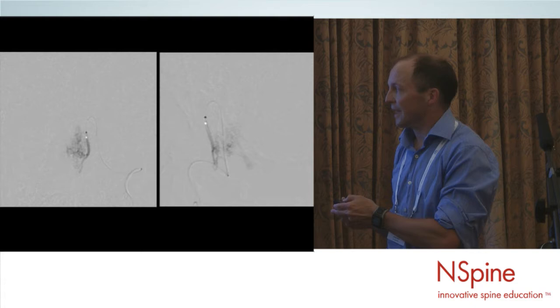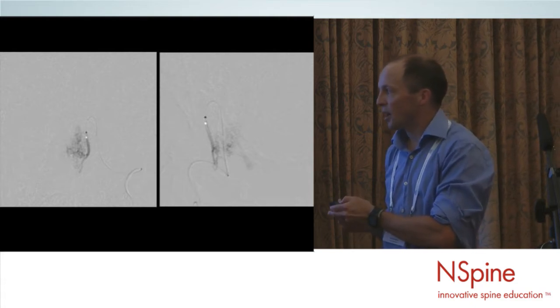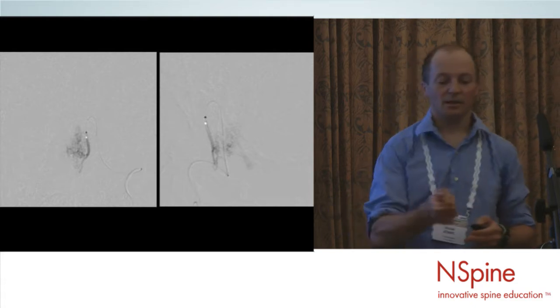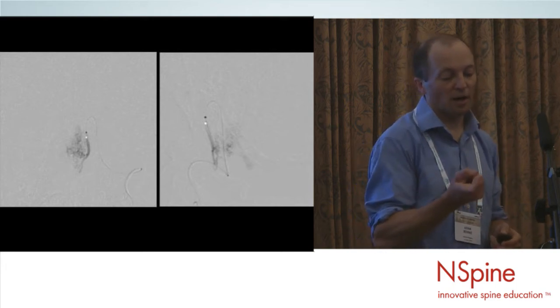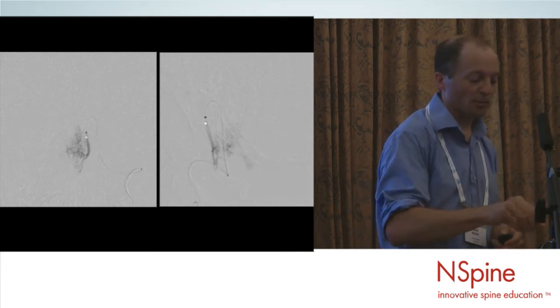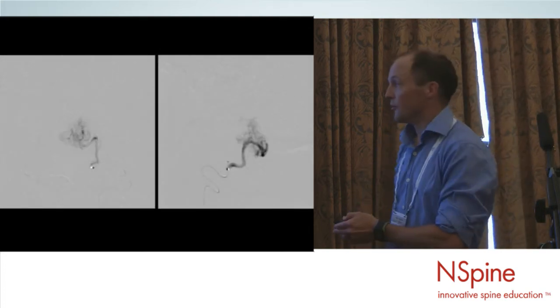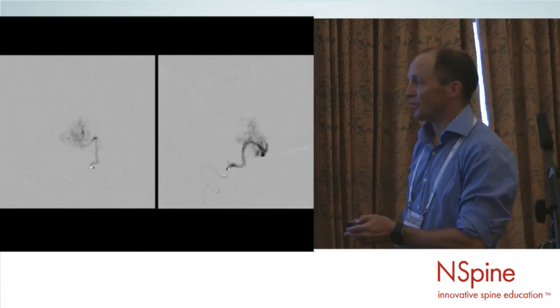So this is some lateral projection. This is the AP injection, and you can see the little feelers going up into the sulcus and up into the nidus itself, and they're the ones we want to get into, those little hooped sulcal arteries. And just to prove it from the back, I've kept the projections exactly the same.